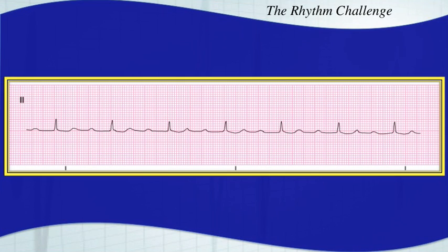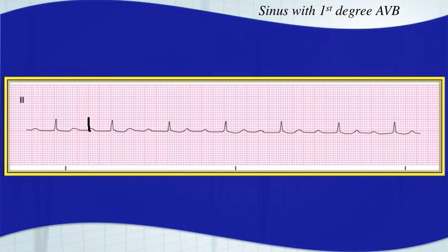Take a good look and hit pause when you're ready to interpret. This is a sinus rhythm with a first degree AV block. You have a consistent prolonged PR interval.